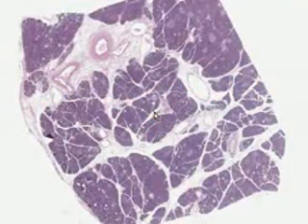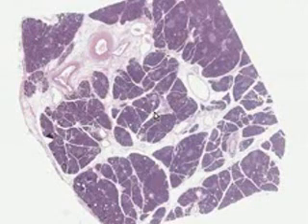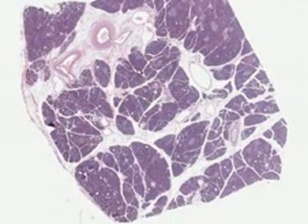The beautiful thing about the pancreas is that it is a classical exocrine gland. In fact, it could very, very often be confused with the parotid gland, except for the fact that it has these little white islands inside of it called the islets of Langerhans. Otherwise, on an average day, I could believe it was a salivary gland with 100% serous acini like the parotid. But let's go a little bit deeper and review exocrine in general.